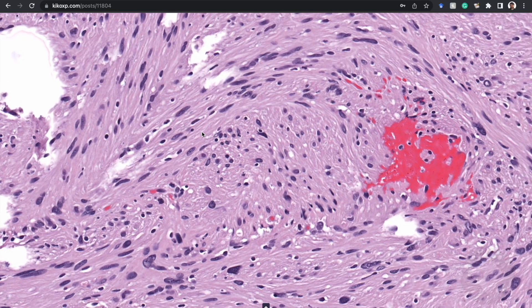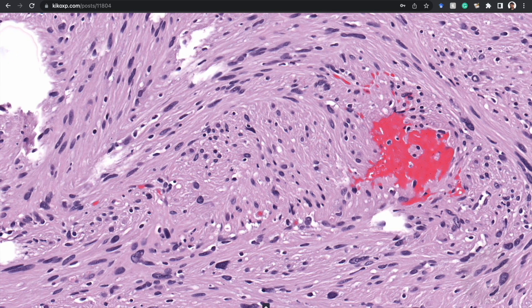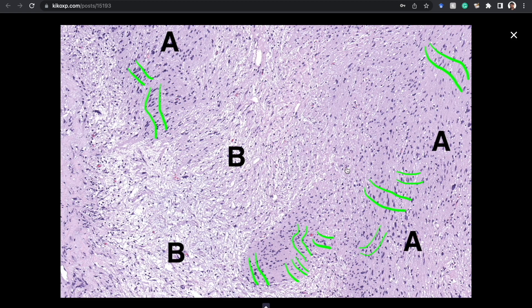The palisading is here but it's quite subtle, so let me show you — I took some screenshots from this case and marked them up for the purposes of posting online, just yesterday actually. Here's a screenshot: the hypercellular areas are Antoni A, and that's where Verocay bodies and palisading usually are, because you need cells to make a Verocay body. Verocay rhymes with A — that's how I learned it in med school and I still find it a useful way to think about it.